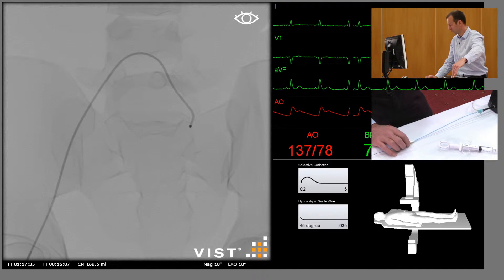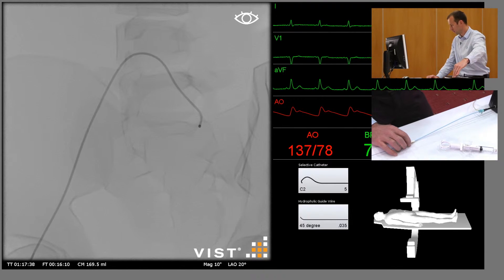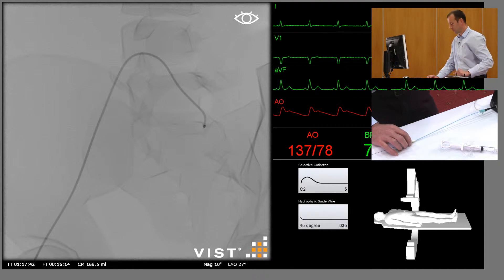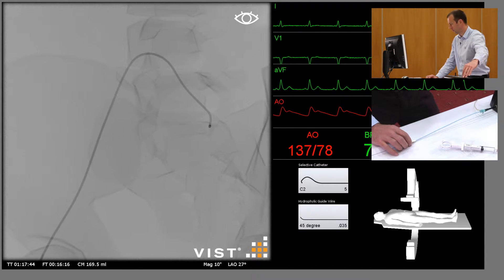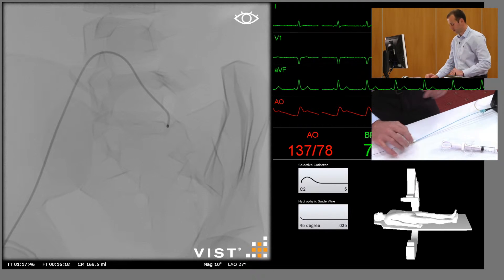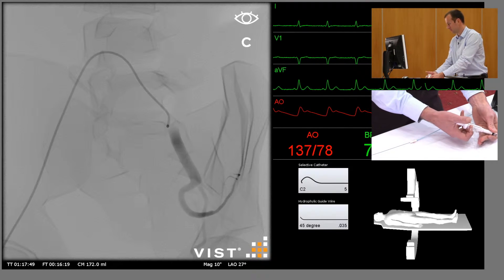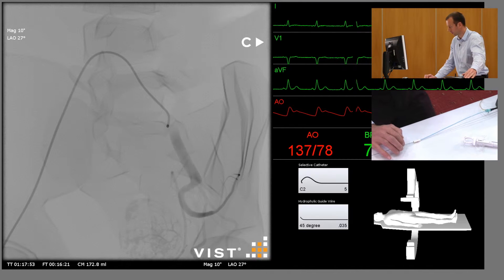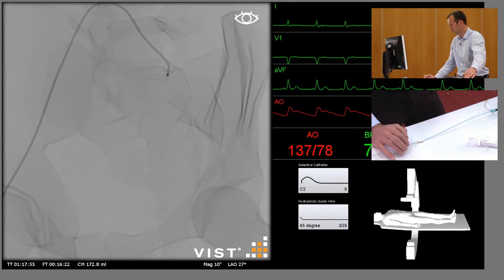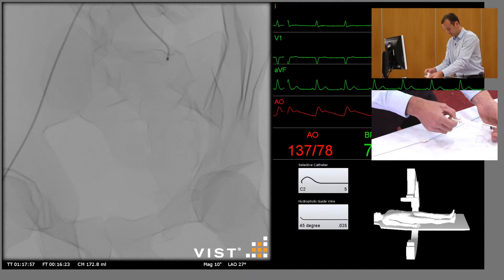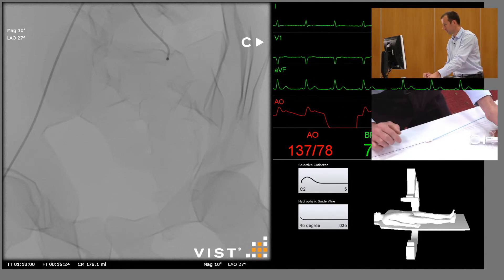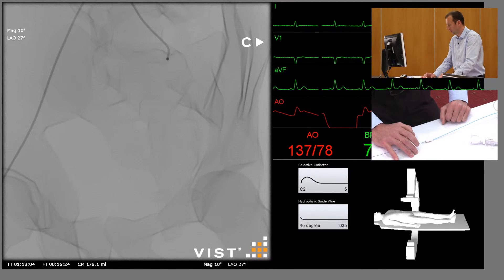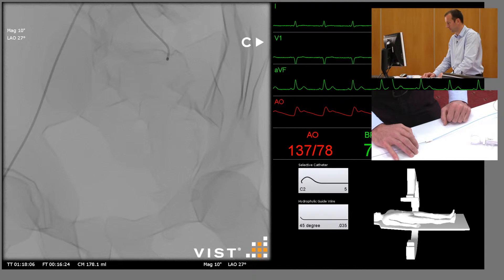Generally speaking, the best angle to look at this is a left anterior oblique for the left side. Again just repeat the angiogram — I think we need to centre a little bit further south — and there we can see the bifurcation into the anterior and posterior divisions, and in fact we can see the main uterine artery on the left.